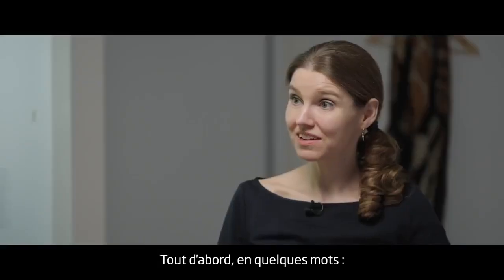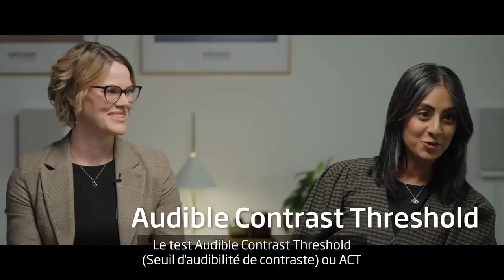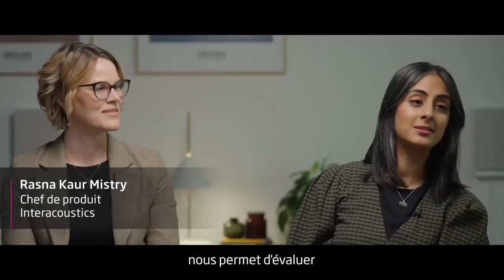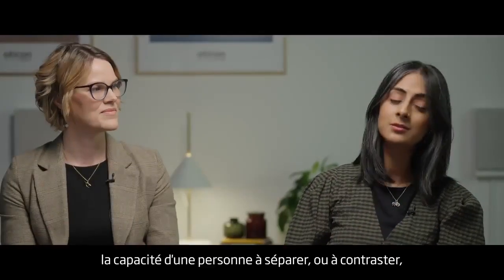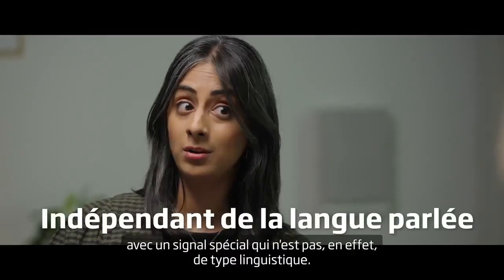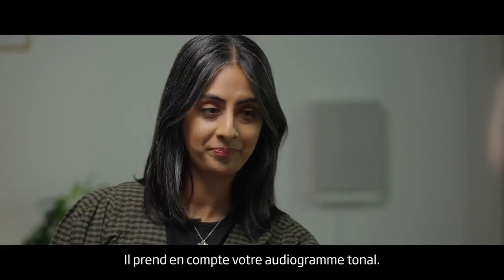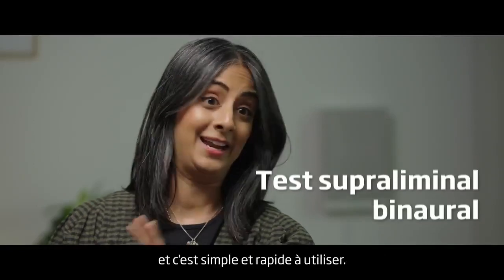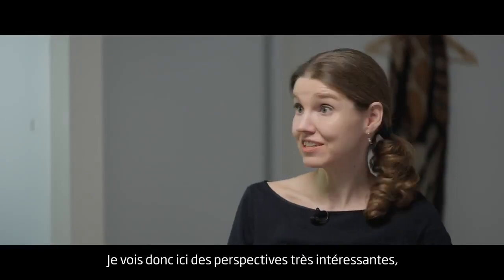So first of all, short and sweet. What is ACT? The Audible Contrast Threshold Test, or ACT, allows us to assess somebody's ability to separate or contrast speech from noise with a special signal that's actually non-language specific. It takes into account your pure tone audiogram, so this makes it an above threshold binaural test, and it's quick and easy to use. So I see some very interesting perspectives here.